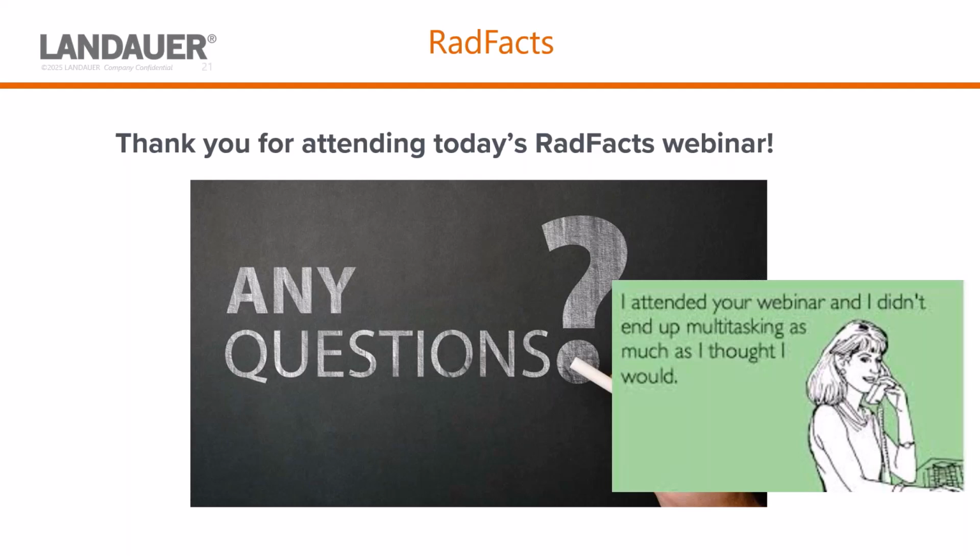That's separate from RadFacts. RadFacts is really just looking at the KPIs and tracking that information. So RadFacts itself does not provide you with the letter or the memo for the ALARA exceeders.